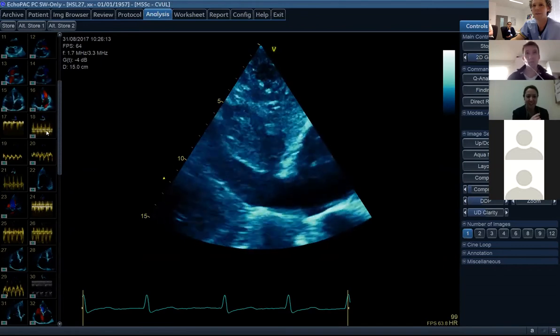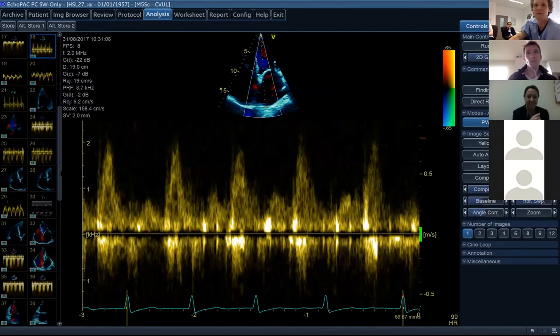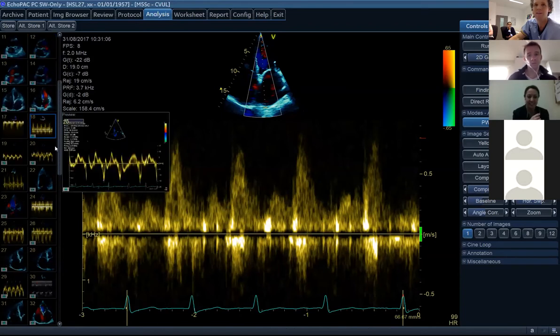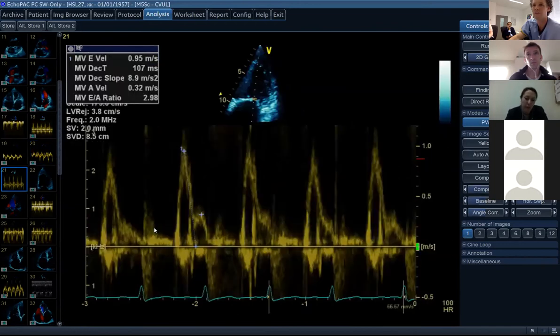Show me the EAs again. I think that looks like a pretty good S and D wave. And where is her... You know, if you look at her E prime, I think we've got an E and A wave. Okay, yep. Good question. Just because when I was looking at the EAs, I wasn't sure how many A's you can really see. I think she's in sinus rhythm, but she's also got a heart rate of 100, so we may be getting some E and A fusion going on. Yeah, she's quite fast, but then you've got one there.